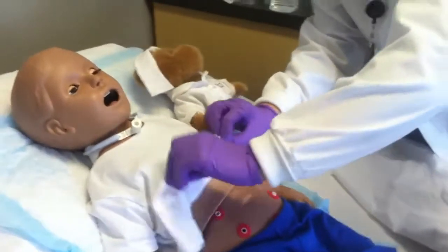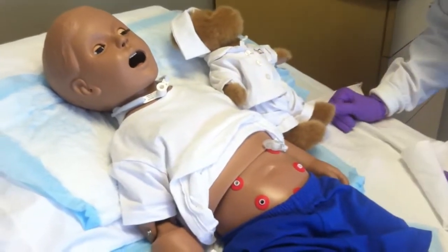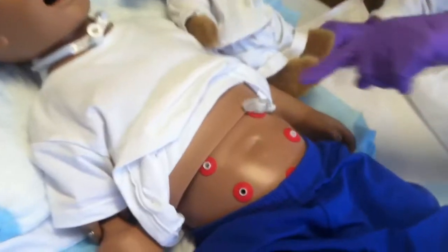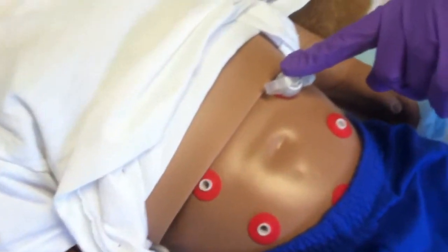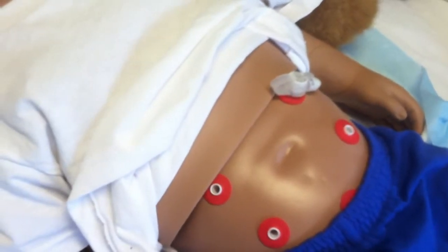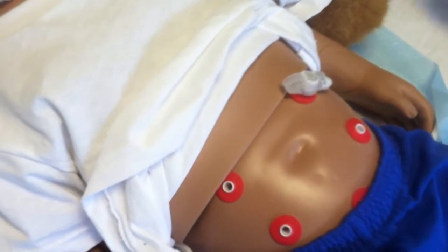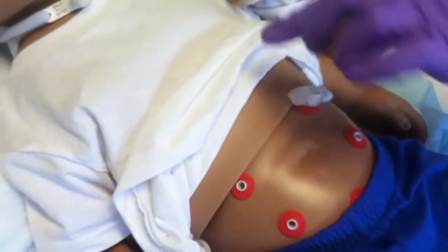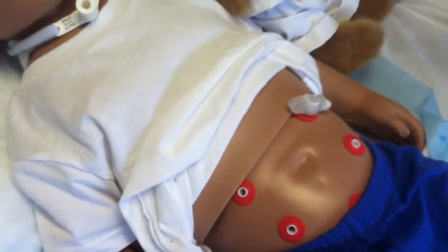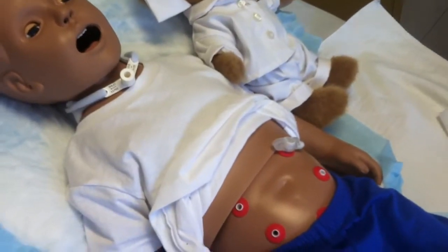Expose the Mickey site. The first thing you do is assess the skin around it. What does it look like? Is it excoriated? You can move this up and down real gently to see the skin underneath. You're looking for bleeding, signs of infection, edema, anything that looks abnormal. We eventually want to see this G-tube stoma look beautifully healed like a belly button would, just regular skin. It should not look red in any way.